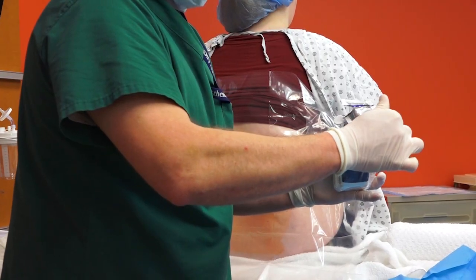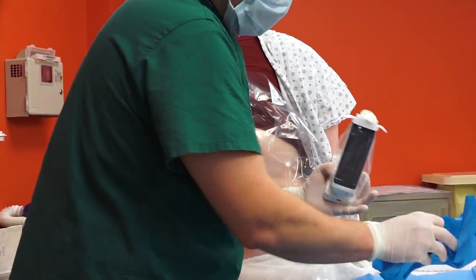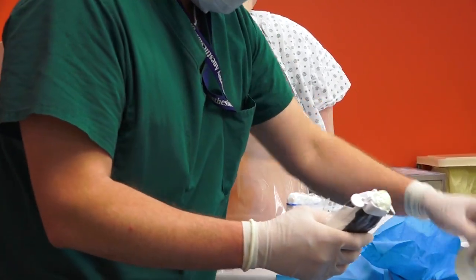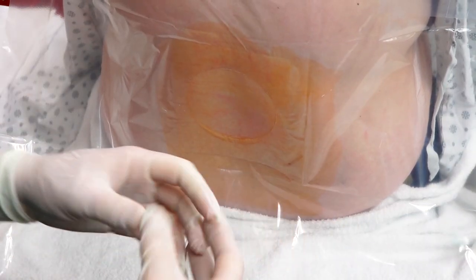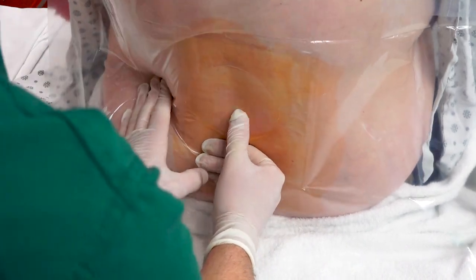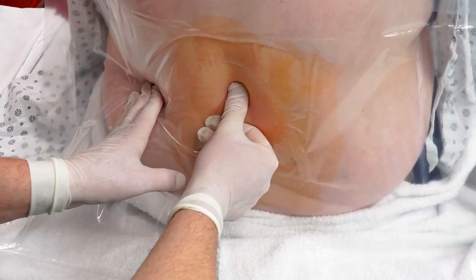Just prep your epidural kit as you would normally do. Now we are ready to scan the patient. When you're starting with Acuro, always palpate again — make sure that you go up to the hips and feel for your midline.